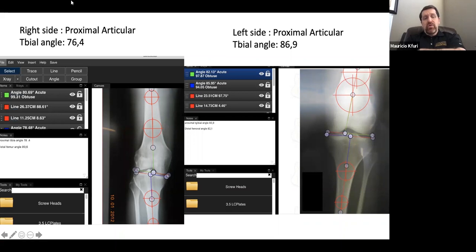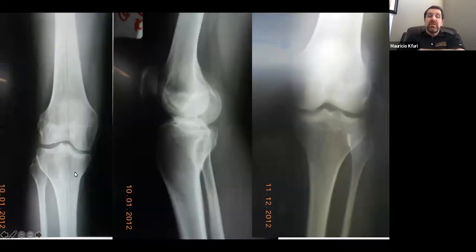In this case, if you look at the lateral column of the tibia, there is nothing abnormal with the lateral column of the tibia. The lateral cortex is intact. It gives me a sense that most of the deformity is coming from one compartment. But this kind of assessment that you're requesting, exactly where it's pointing out, yes, exactly there, you see, looks very normal to imagine that you have a metaphyseal deformity there. You may have, but it's not typical when you have a unicondylar fracture or unicondylar malunion, because this is the area that's displaced.